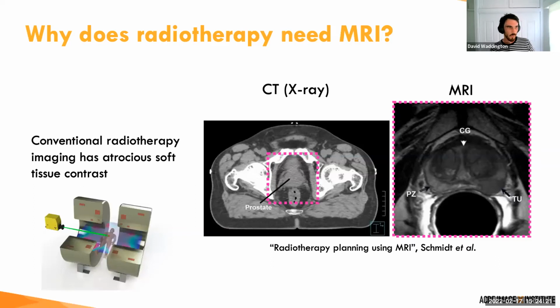One of the real developments in the last few years, and what we work on here at ImageX, is the idea of this MRI linac, an MRI system combined with a linear accelerator. What these MRI linacs do is image the person in real time as X-ray radiation therapy is delivered. This is a schematic of our prototype MRI scanner at Liverpool Hospital, and we have a number of projects running across this. I thought I'd run you through, in very high level detail, some of the things we're working on.